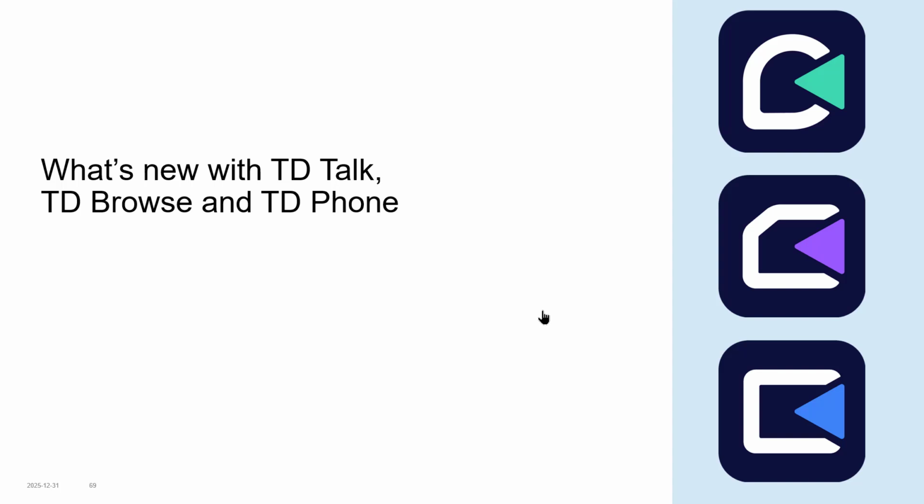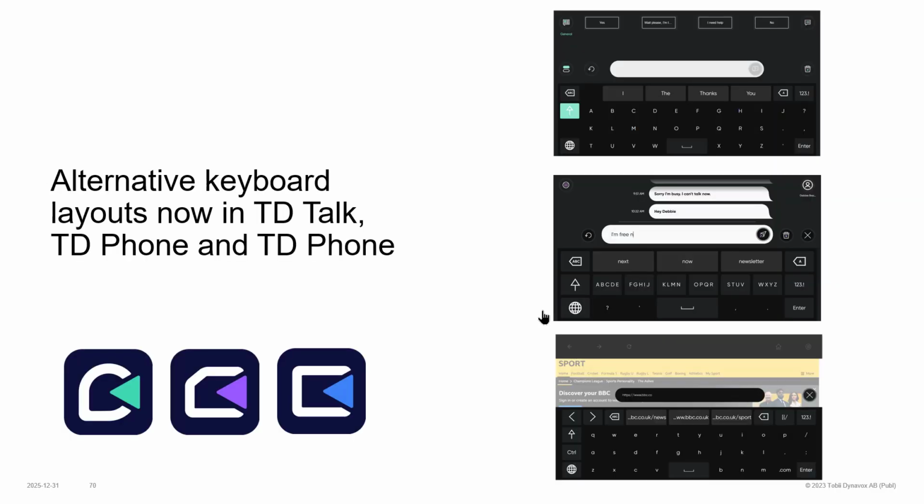Right, so next then, we're going to have a look at what's new in TD Talk, TD Browse and TD Phone. In addition to the voices we talked about earlier, the biggest addition to these programs is the new option to have alternative keyboard layouts to meet your access requirements.